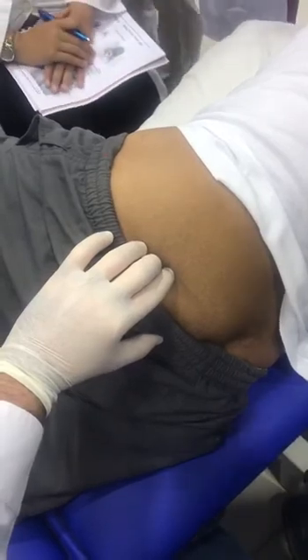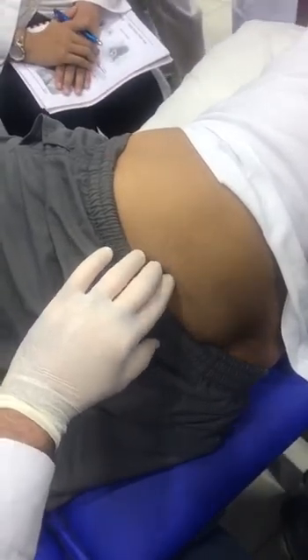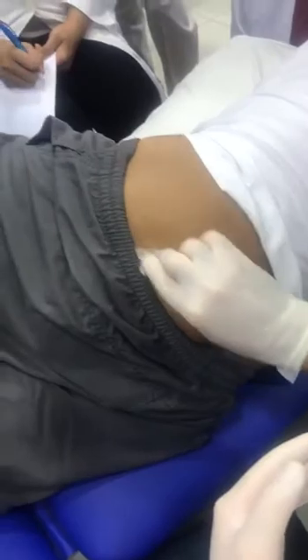Which needle are we going to use? What do you think? Yeah, 50. Usually gluteus maximus is very thick, so I think we will need 50, but if we have a big patient, we can even use 60 or 75. For this patient, I think 50 may be good, depending on the size.